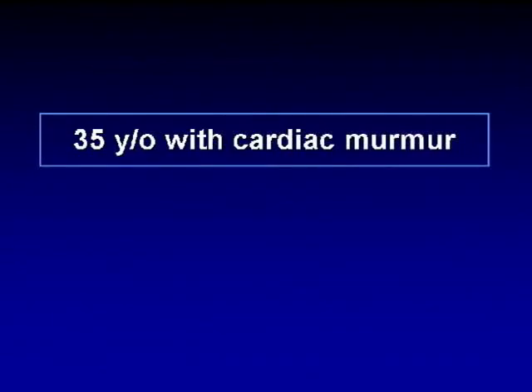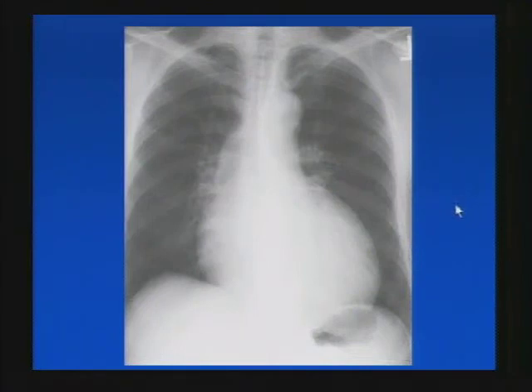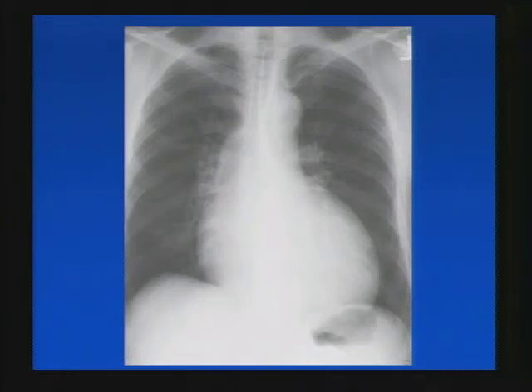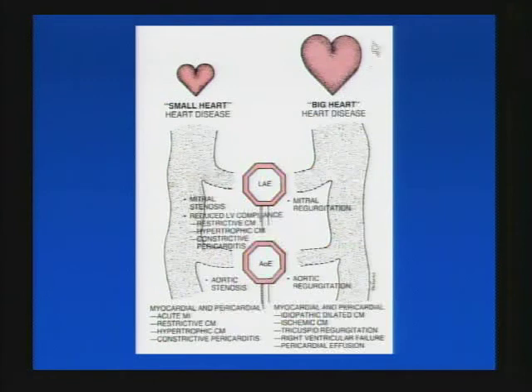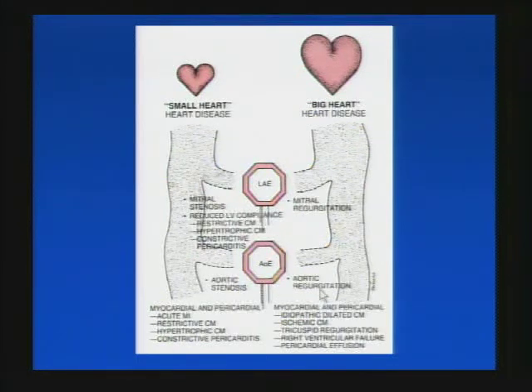Next case: 35-year-old with cardiac murmur. Using our approach to acquired heart disease on plain film, this is definitely an enlarged cardiac silhouette — large heart disease. Looking for signposts, we see aortic arch enlargement, which points us to the aortic valve. With a large heart, we think aortic regurgitation. To review big heart disease: left atrial enlargement suggests mitral regurgitation; ascending aortic enlargement suggests aortic regurgitation; when no signposts are present, think myocardial and pericardial disease.